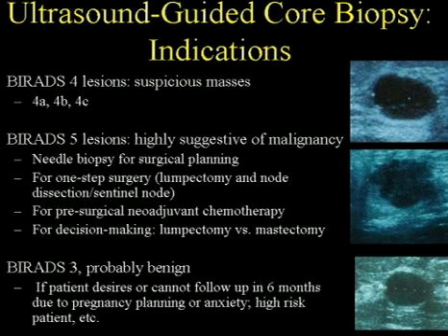And lastly, some BI-RADS 3 lesions are biopsied. BI-RADS 3 lesions are probably benign, and usually only a 6-month follow-up is recommended. However, if the patient desires or cannot follow up in 6 months due to different issues such as pregnancy planning or anxiety, then these lesions can also be biopsied. Also, sometimes in high-risk patients, there's an overall increased risk, so we may biopsy BI-RADS 3 lesions in high-risk patients.